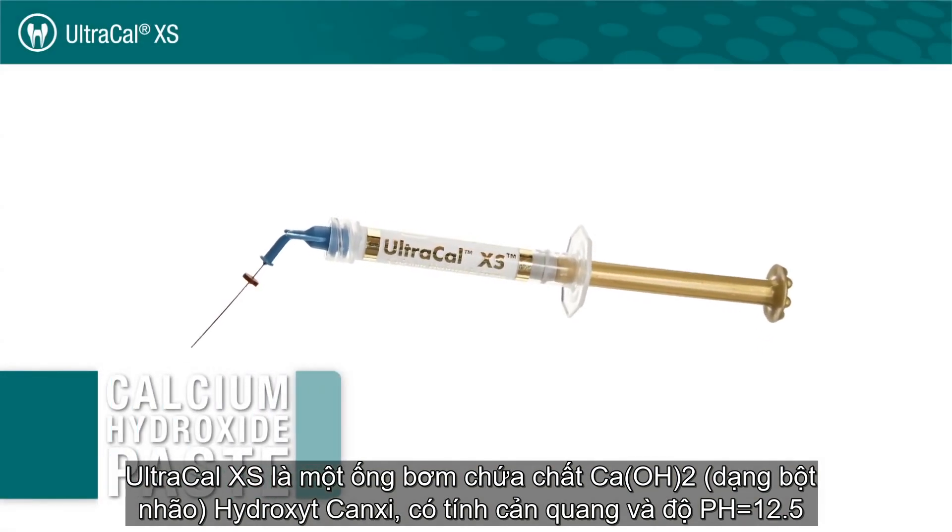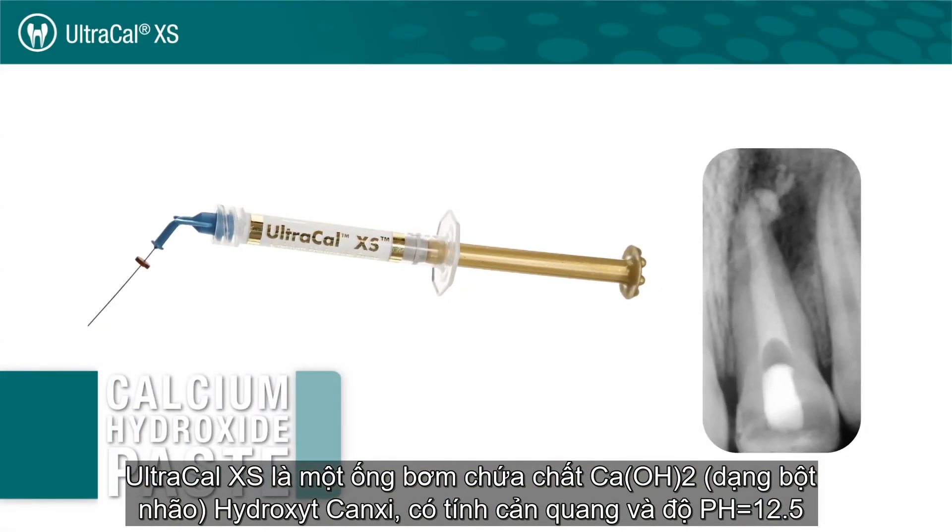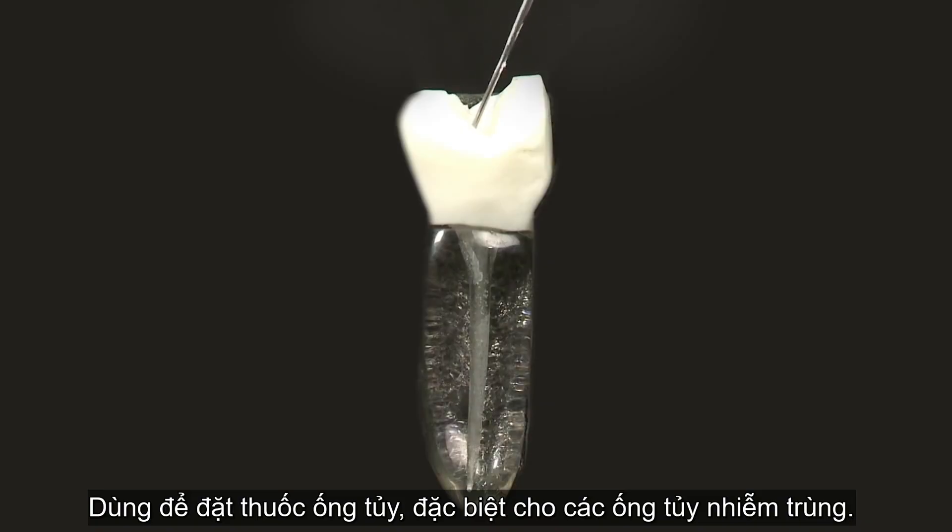UltraCalXS is an aqueous, syringe-delivered calcium hydroxide paste with radiopaque properties and a pH of 12.5. It is used for apexification procedures and as an inter-appointment canal treatment dressing.